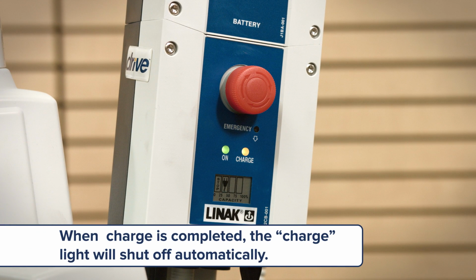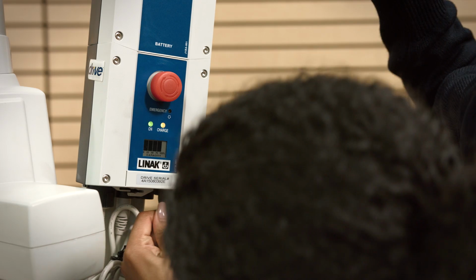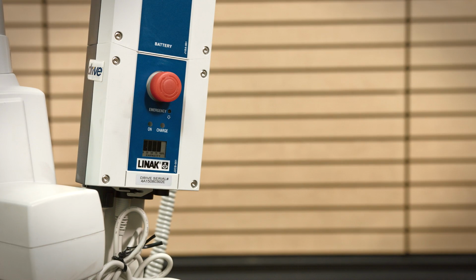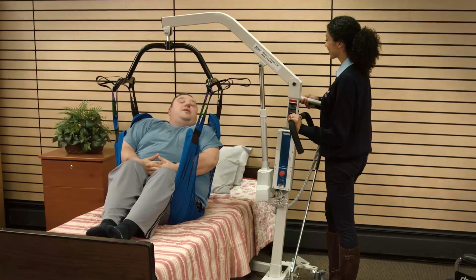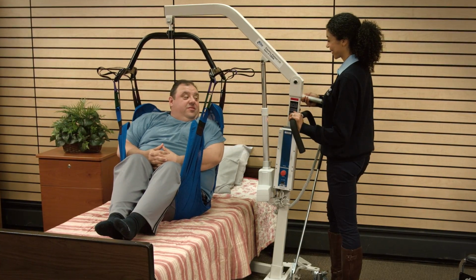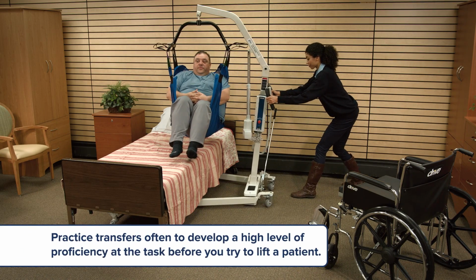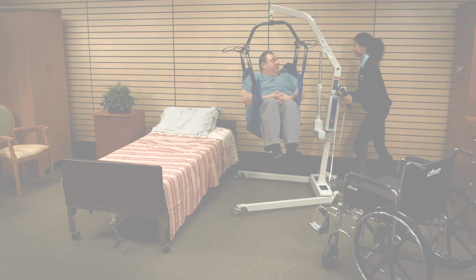On average, it takes approximately 4 hours to charge from 50% to 100%. Remove the power supply cord. The lift is now operational. The bariatric patient lift will provide you with a safe and comfortable way to transfer a patient from one resting position to another. Practice transfers often to develop a high level of proficiency before you try to lift a patient.